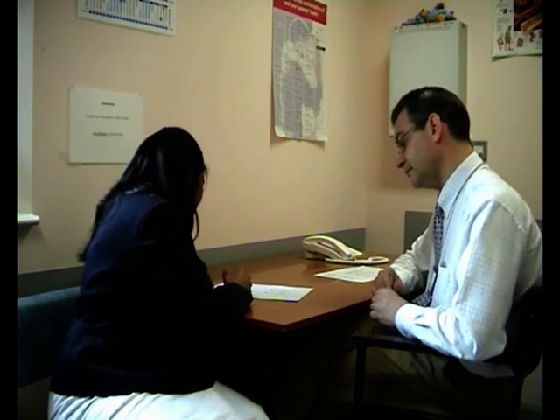So we have a patient here, and it is a cystometrogram done on the 19th. And it has 5 lines. The first of which is the volume infused, which is measured in mils, ranging from 0 to 1,000.